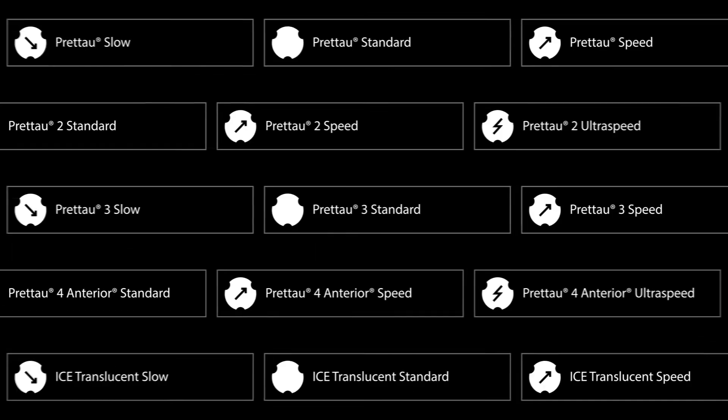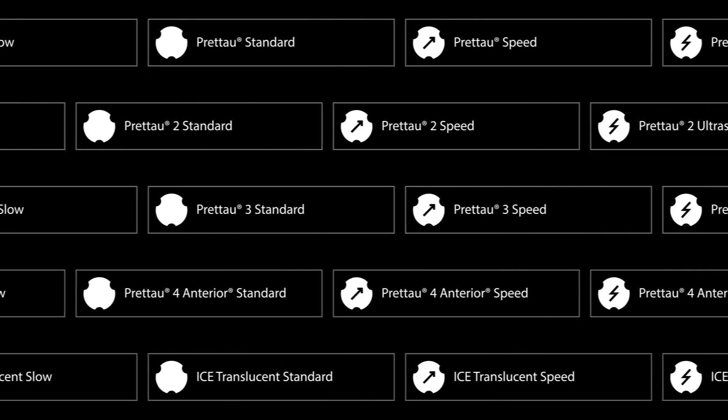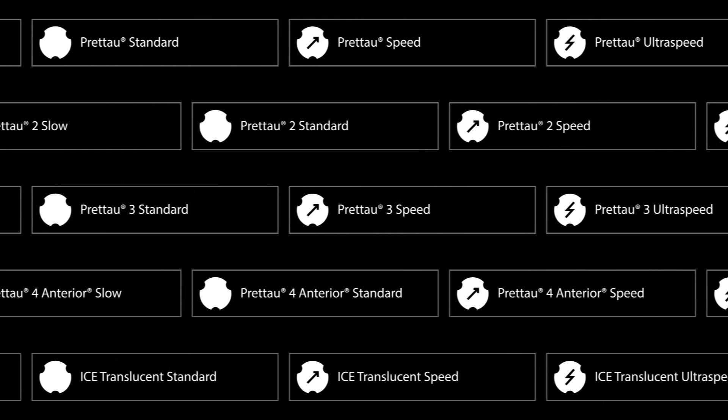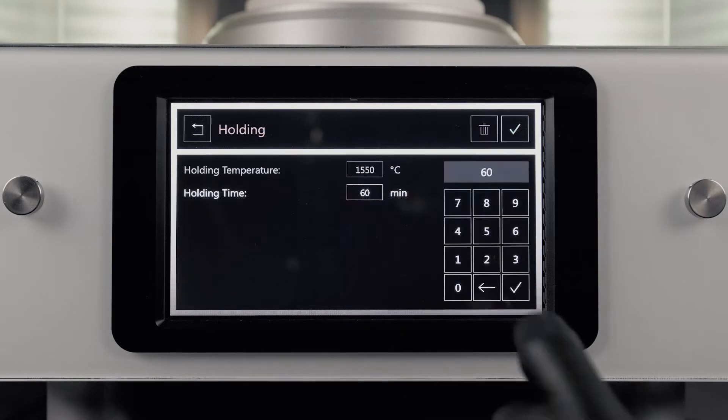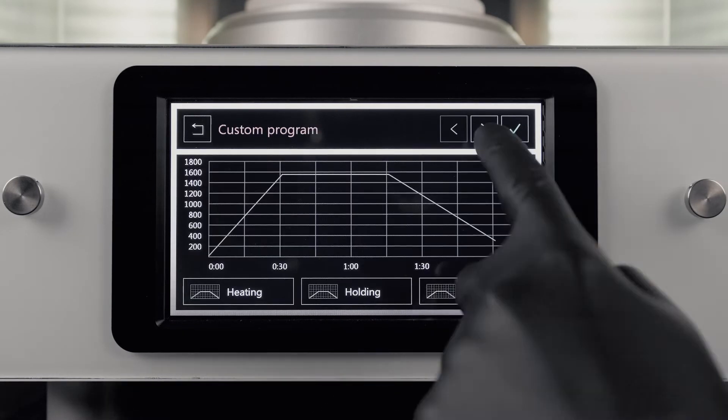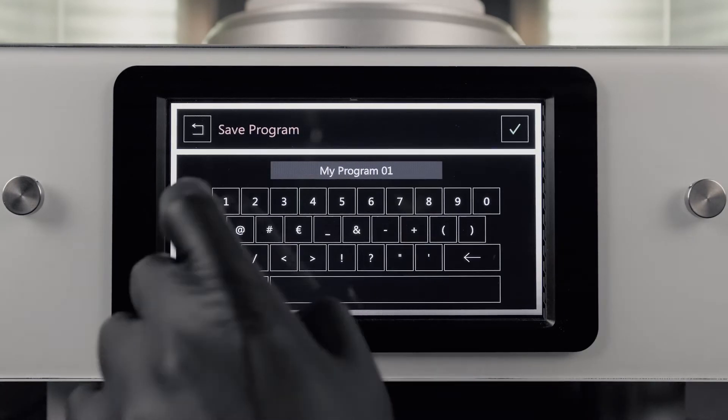The furnace is preloaded with several sintering programs for each of our zirconia types. However, if the predefined programs are not enough, or specific heating rates are required, it is also possible to create your own sintering program.